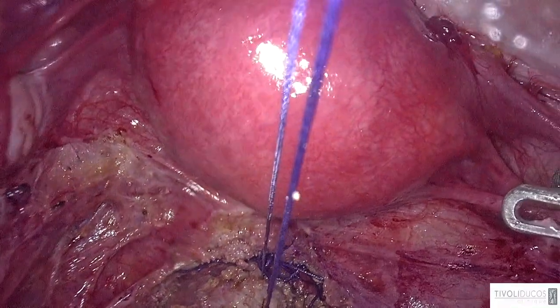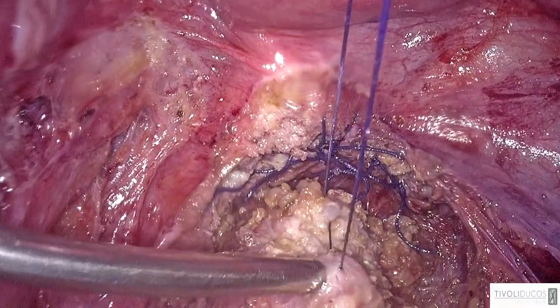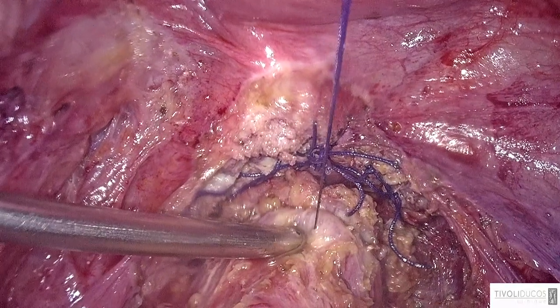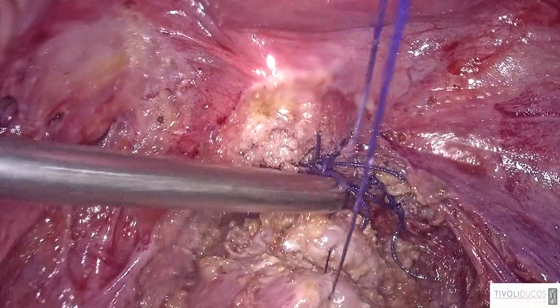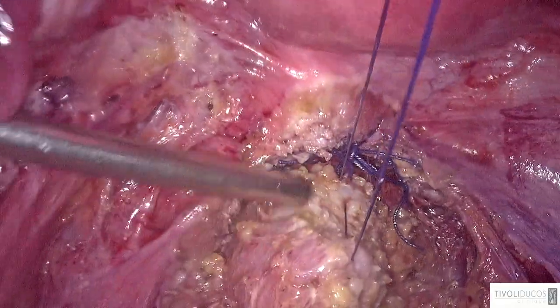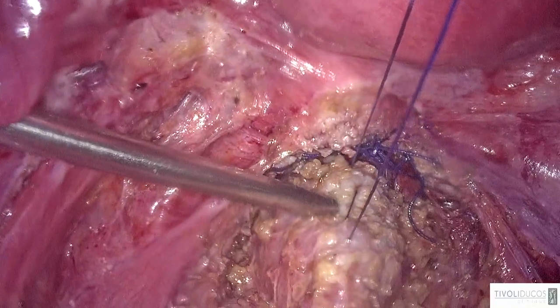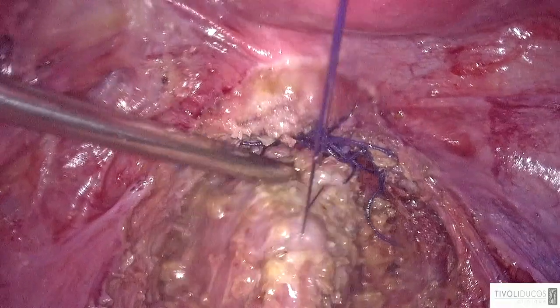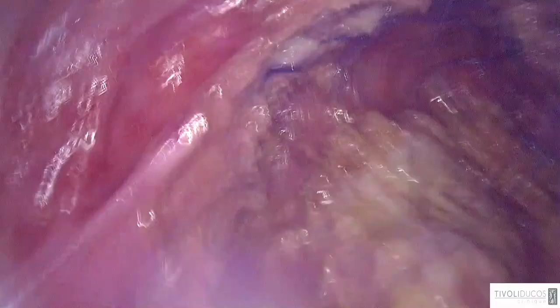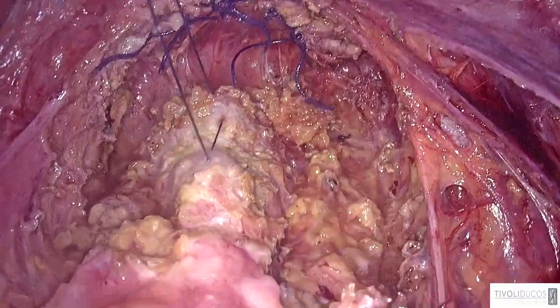So, you see, if I do the knot, the shaved area will disappear into the rectum. But in this case, I will create another stenosis. That's why I have to wait for my colorectal surgeon. This is the next step of the surgery. He pushes the circular EEA stapler into the rectum. It opens the stapler, and then I will do the knot to push inside the shaved area, and then he will remove it. So we'll show you how we are doing this.